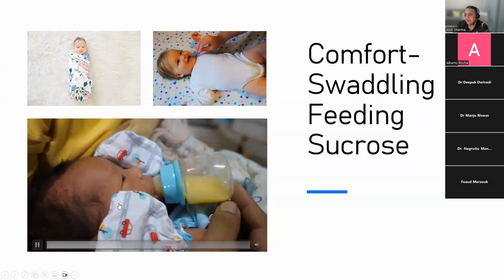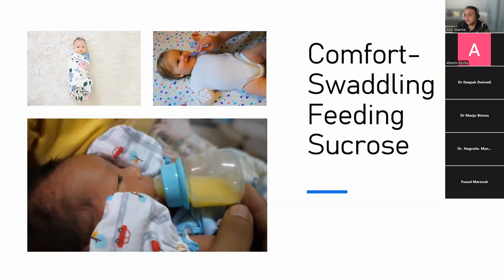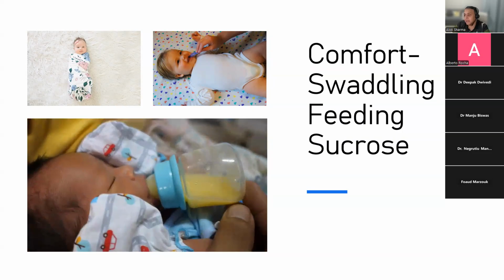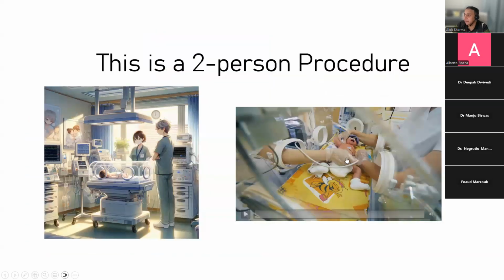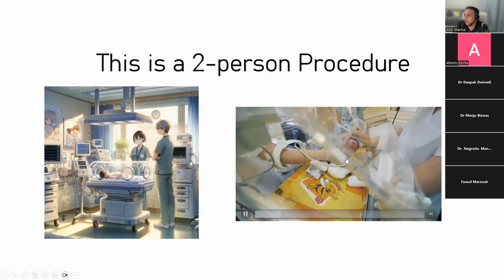So you can see this baby's nice and comfortable. You can do a scan anytime. He's not going to worry about it. Nice and content. Beautiful. Look at all that milk. Nice colostrum there. It is a two-person procedure for the reason I've already described.